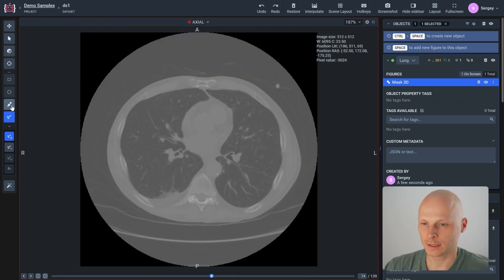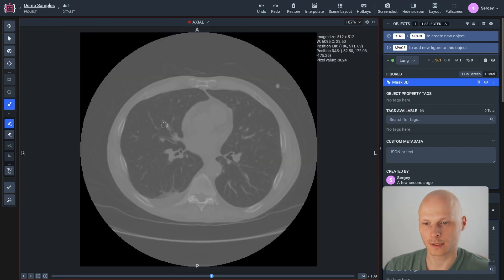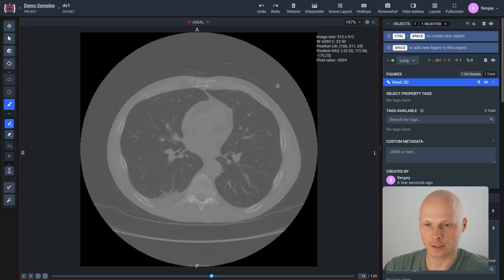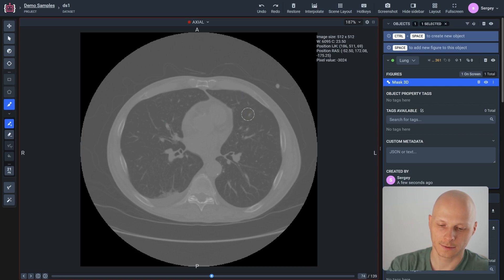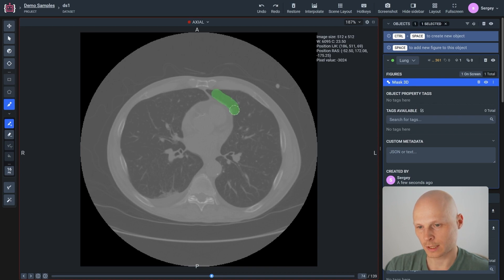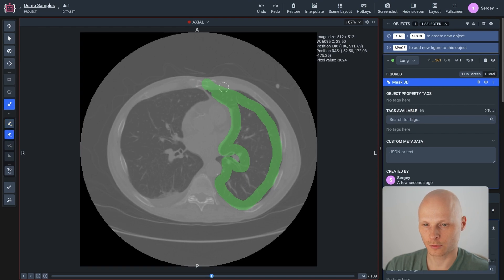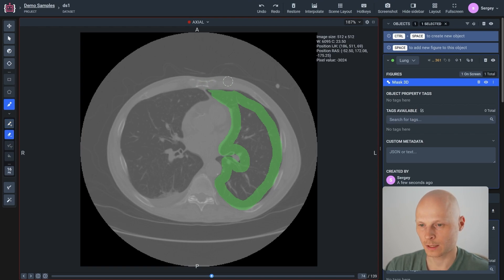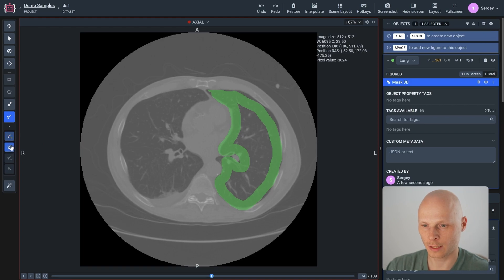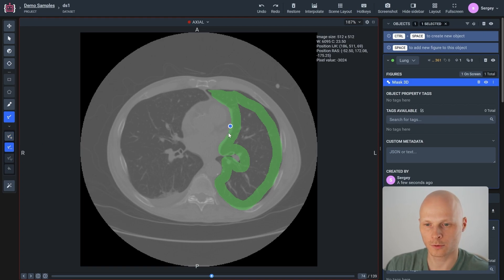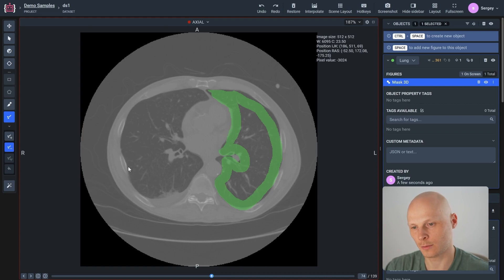Let me select the brush tool for another slice. I can configure the size of the brush using hotkeys. For example, I will mark these slices. If I make a mistake, I can use the erase tool to correct my mask. I can also use the pen tool and activate the polygon cut mode to slightly correct the edges of my original mask.